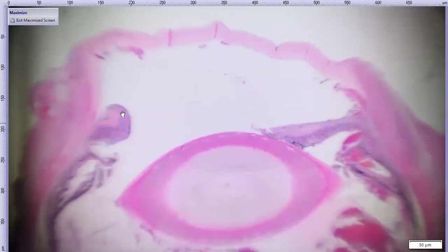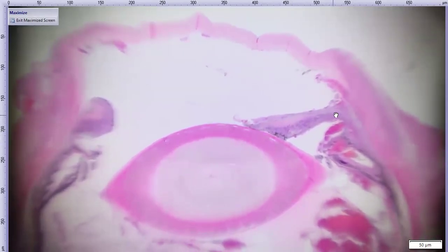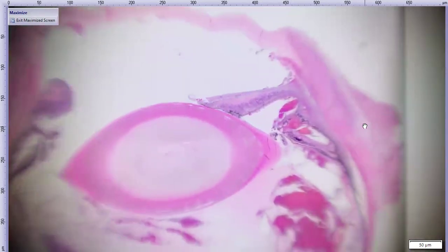Okay, so cornea is up top. I'm going to get it more in view for us. There we go, here's our cornea. It's not very exciting. There's a little bit of vascularization, which they described clinically. Here are our iris leaflets. One of them is pretty distorted, almost like a little nubbin. This one is more elongate and looks more like an actual iris profile. We can see there's more purple in the stroma where there should not be purple, so there's some sort of cellular infiltrate. And there's also this membrane on top of the anterior iris surface, so we can go closer to look at that.